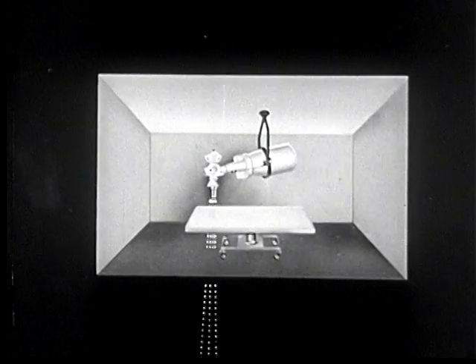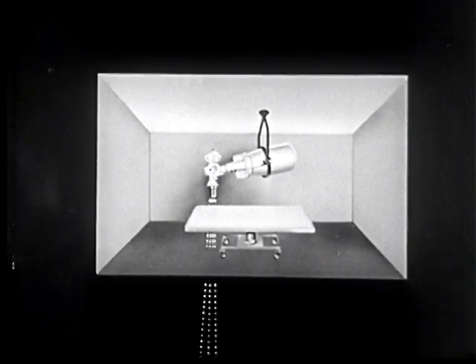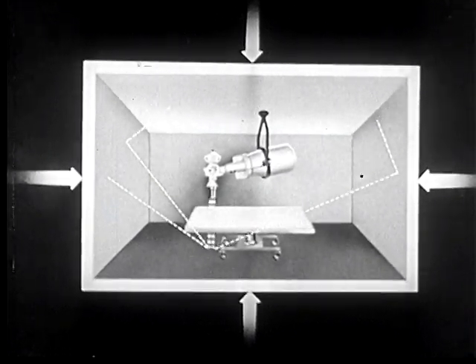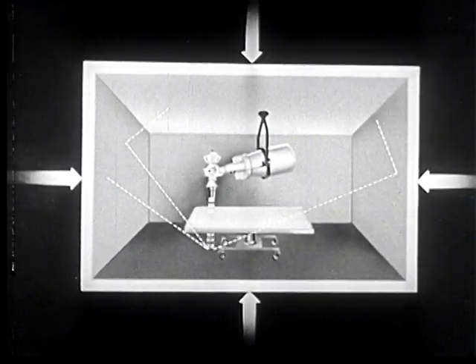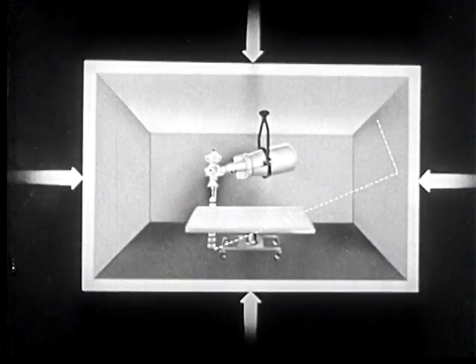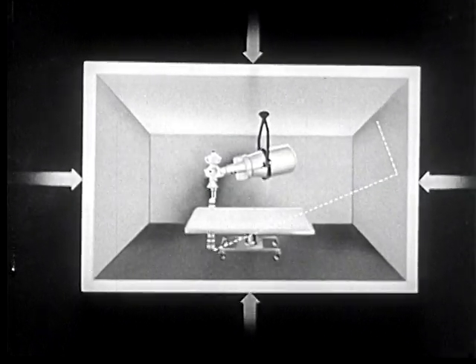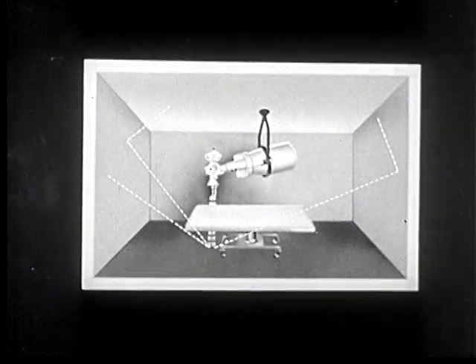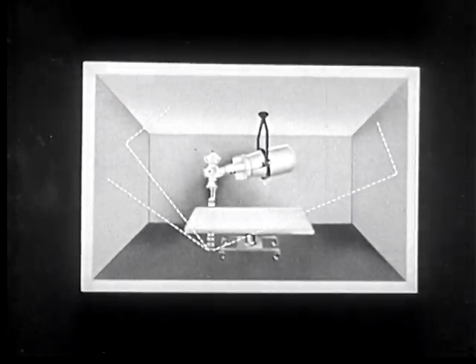X-rays scatter about a room by a process of reflection and penetrate ordinary walls. But by lining the treatment room with lead, the scattered rays are kept within it. The door and the windows, too, are lead-lined. In this way, X-rays are confined to the area of treatment, which is important because the nurse technician should guard against unnecessary exposure to X-rays.